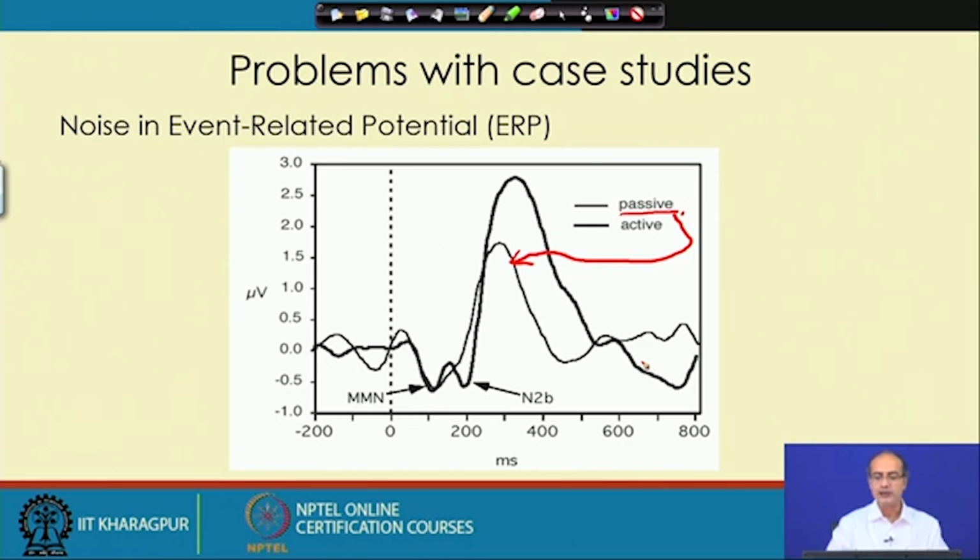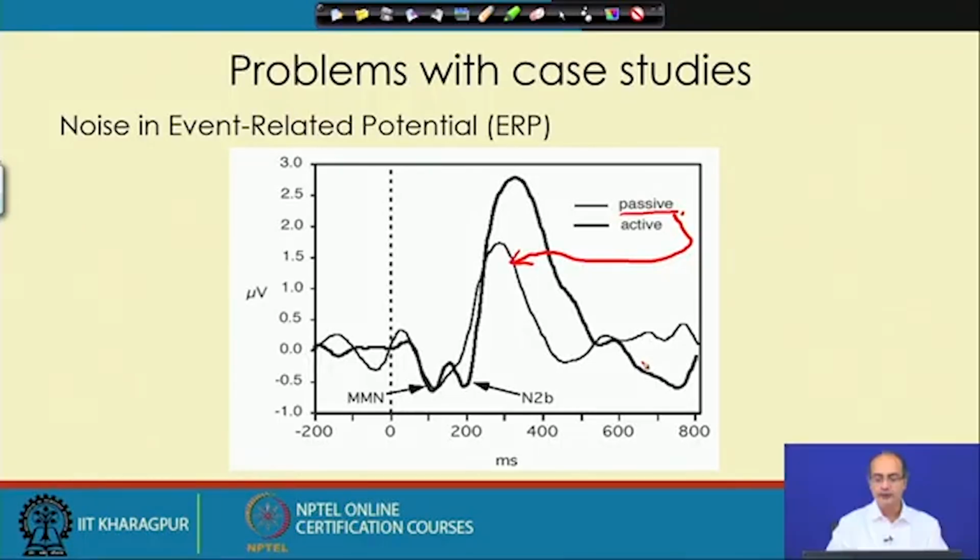we are performing some test of listening. So, first the subject is told to listen to some tunes passively. That means, they will just listen to that, and because of that in the parietal lobe there would be some changes in the EEG signal, and that is the passive signal. Our brain is working, listening to it and recognizing there is a tune played. So, for that a signal is generated.